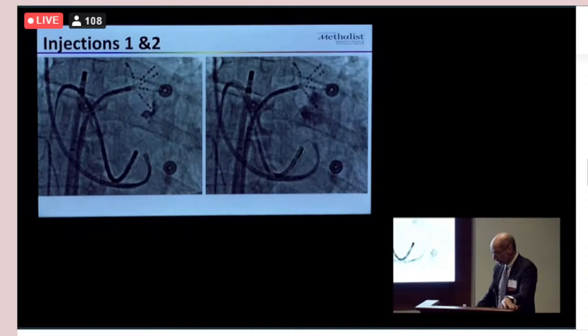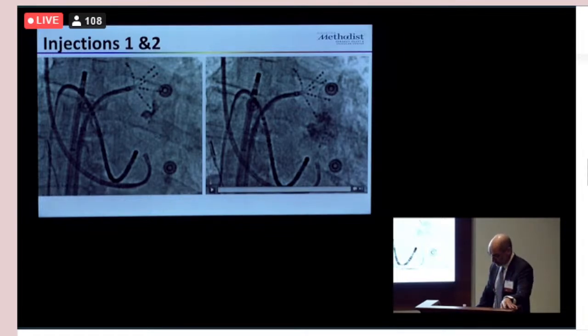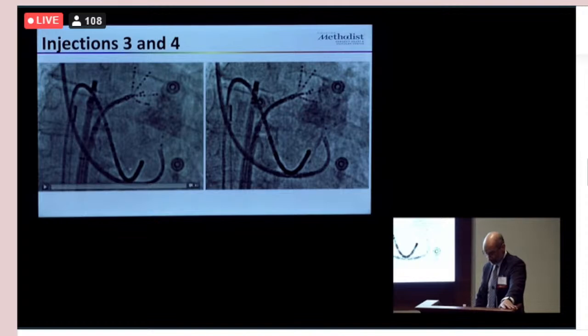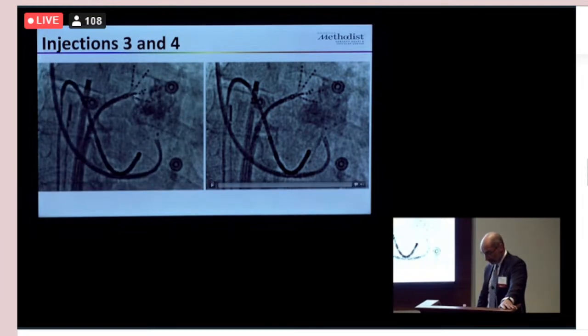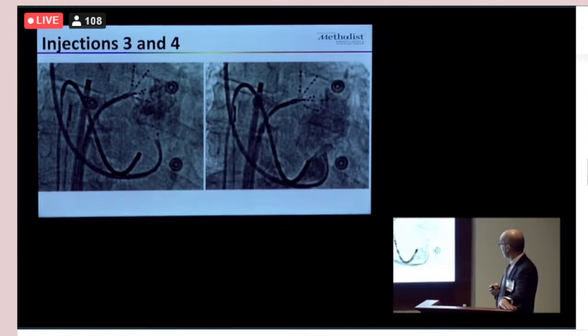Then I retract a little bit, and then I inject 1 cc over 2 minutes. 1 cc of alcohol, 96% is what the manufacturer gives us. I like to inject contrast after to see this myocardial staining that you're seeing there, because that tells you roughly where the alcohol is going. So this is injection number 2. Then we retract the balloon, and we give a third injection. You see the balloon is partially inflated or barely inflated, and a fourth injection with the balloon halfway out so that we inject alcohol as ostial as we can, but as selective as we can into the vein of Marshall. Then we like to inject contrast to see that staining.